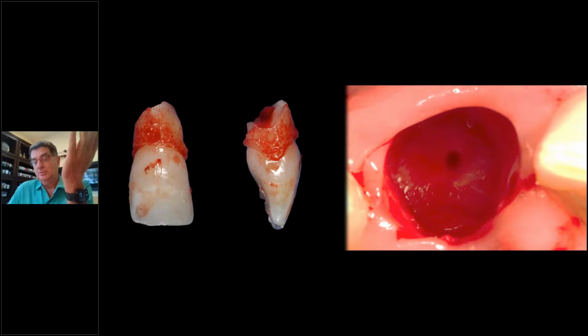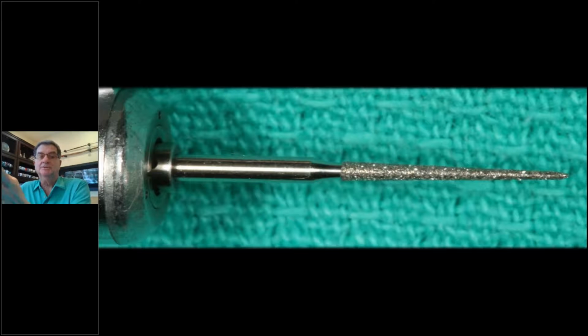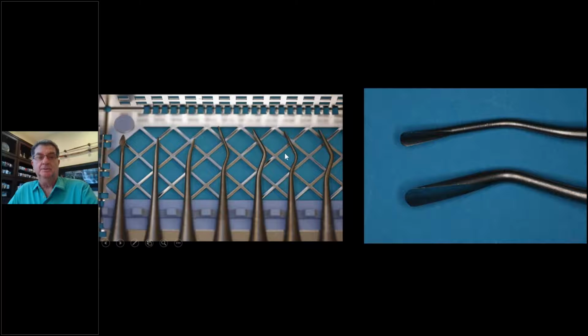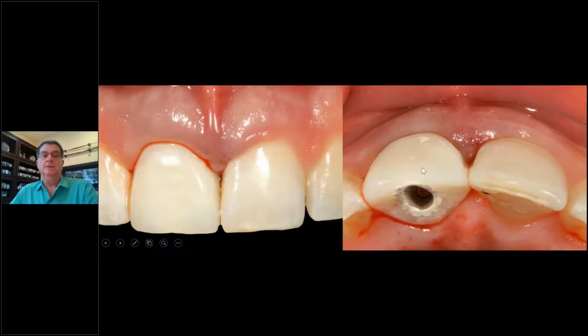What I do, there are a lot of ways to do it. I'll just show you my technique. Long, thin diamond burr. Brasseler makes this, 859 surgical length burr. It's long. I get this tip right between the tooth and the bone, and I open the ligament space up. And then I go in with these PDL elevators. They're not periotomes, they're elevators. They're very small elevators. It goes into the opening that I create with the burr, and then I get the tooth out.